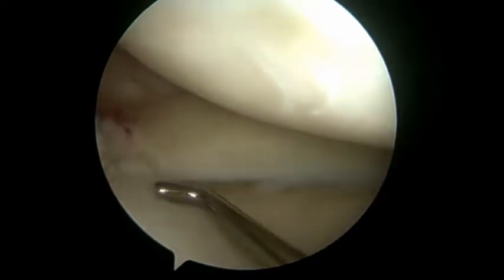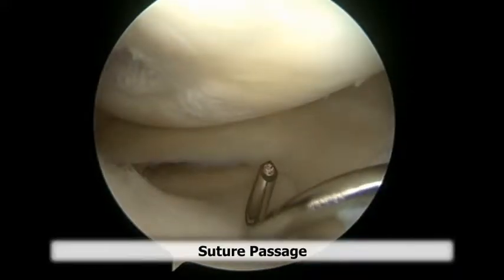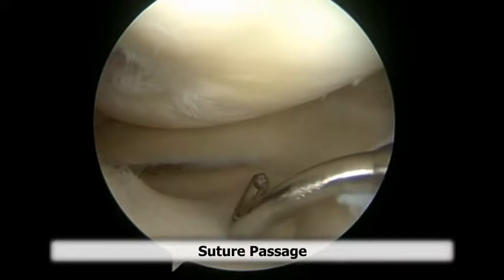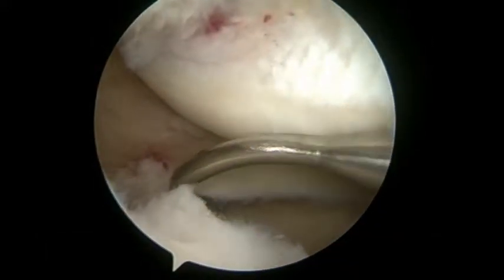A 0 PDS will be used to shuttle the sutures through the meniscus, and here you can see a standard curved suture passer is used to shuttle the PDS through the meniscus.